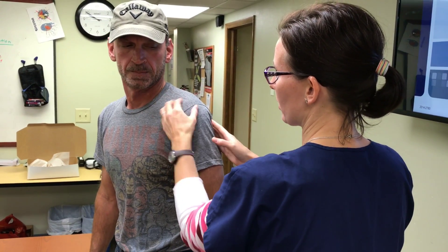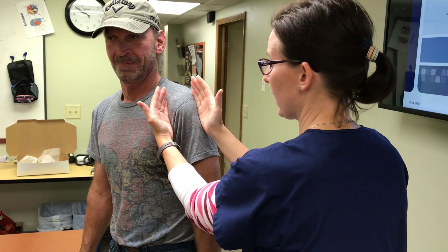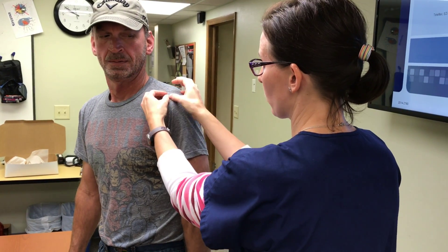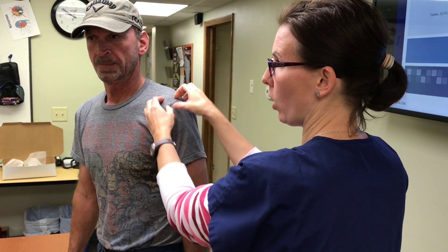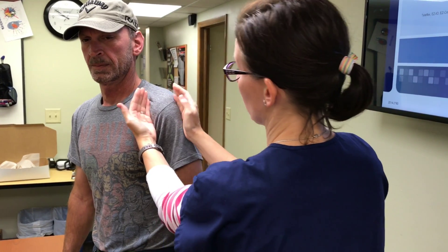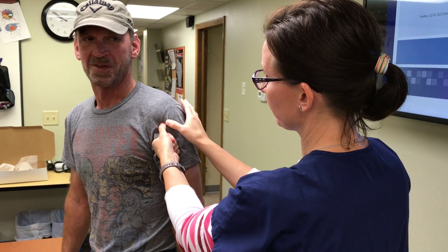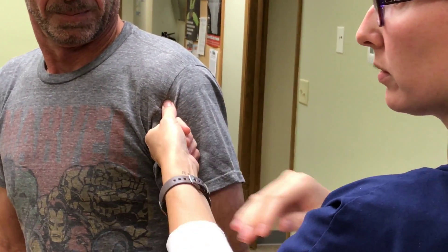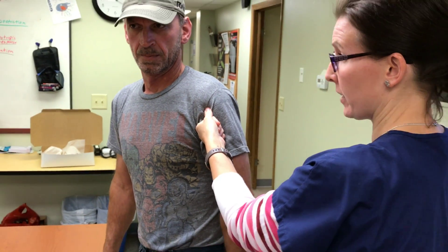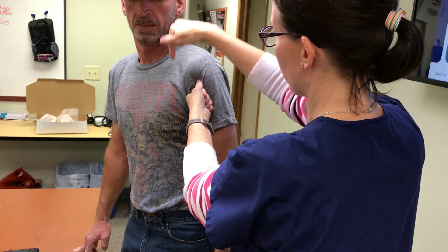The next border is an imaginary shirt sleeve seam — they probably won't have a shirt on, but picture it. Put your hands up like that and drop your thumbs down. Start rubbing with your thumbs and cover some space. Don't walk your fingers because you might miss the drop-off. What you're looking for is where it drops off — basically where the ball drops off the tee. It's easier to feel on someone else than on yourself.